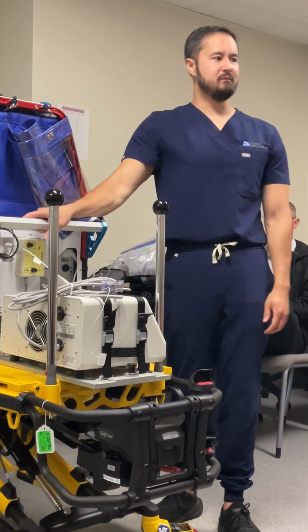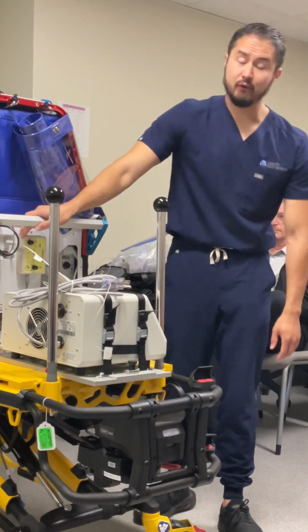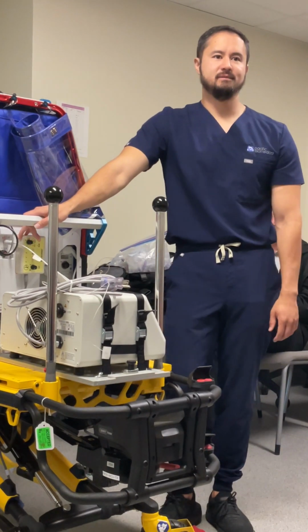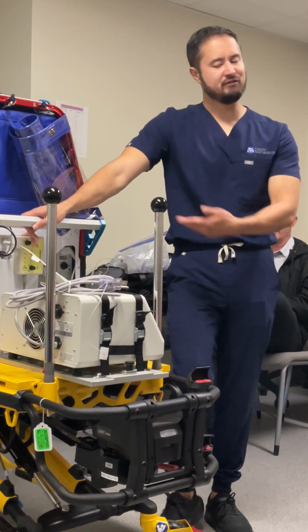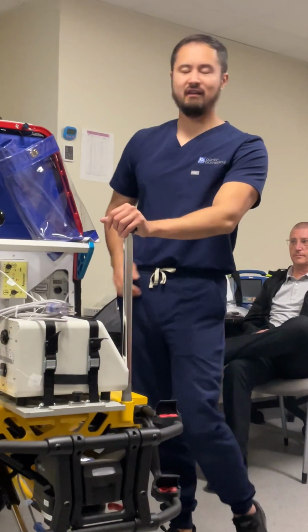Your vent has a control port, yeah. So the Neopod you will not be using. It's just a humidity device for the vents.